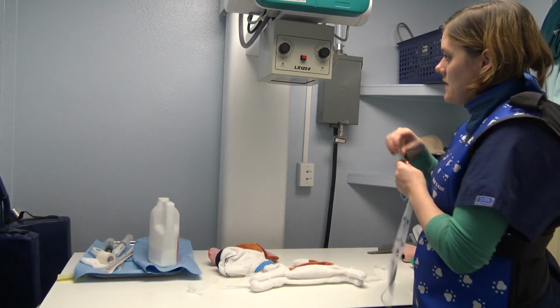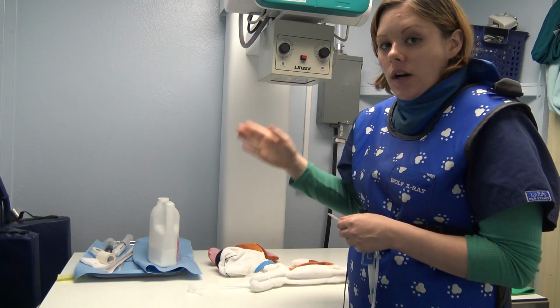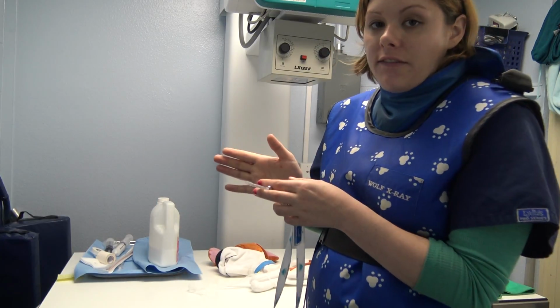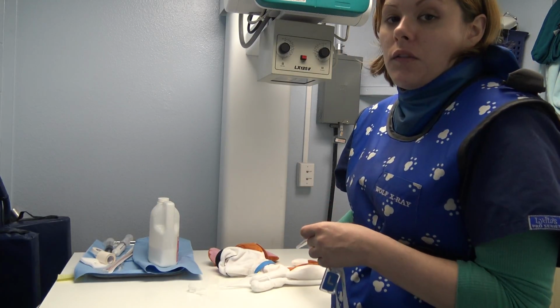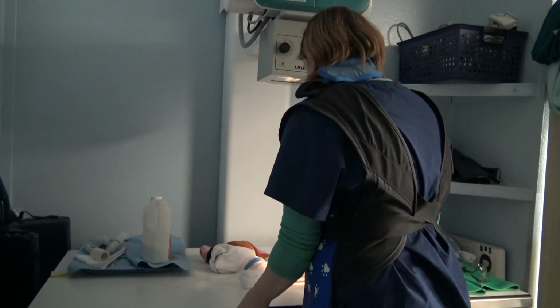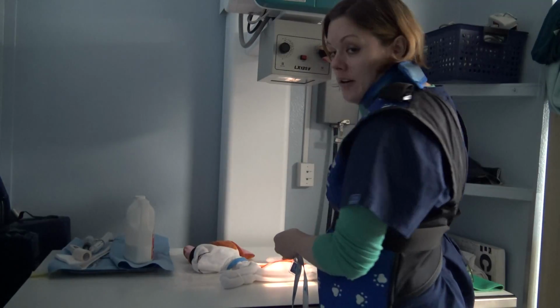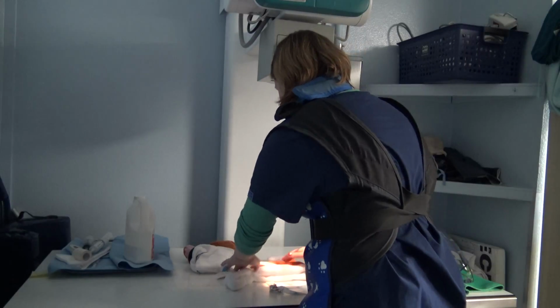Since he's on his right side, we would make sure we have a right marker, and we're going to collimate. For a right lateral view, you want the upper part of your view box around the diaphragm. You want the apex of the heart in there, and then the caudal part at the coxofemoral joint. You want to make sure you're collimated properly to avoid any scatter radiation. And we want to have your marker so you know that you're on your right side.